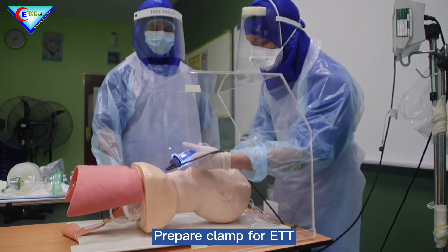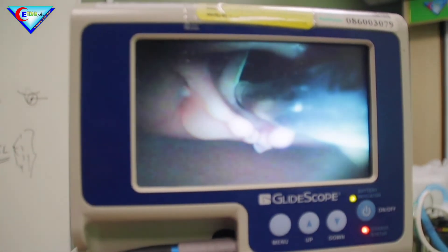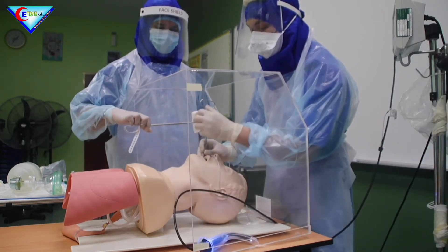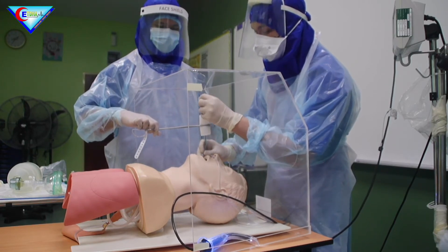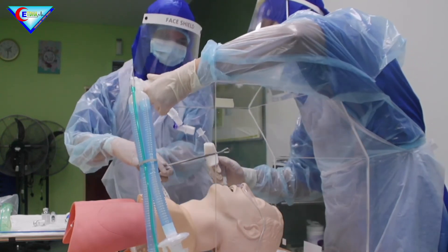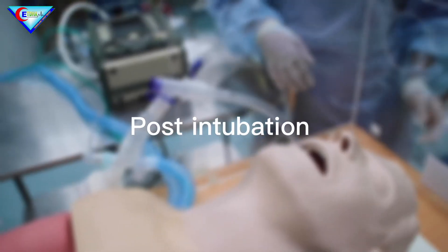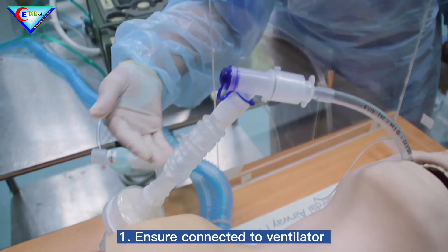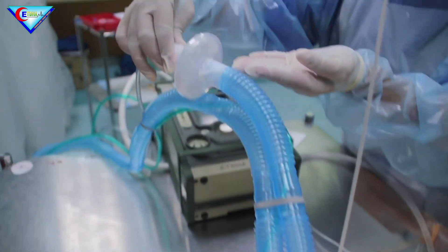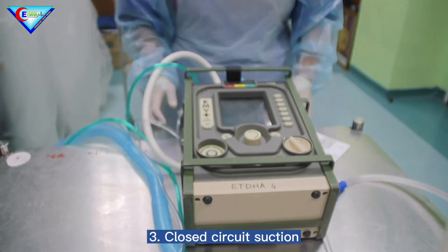Prepare to clamp ETT with gauze. Post-intubation checklist: ensure ETT is connected to the ventilator and all joints are sealed. Check ventilator settings. This is for closed circuit suction.